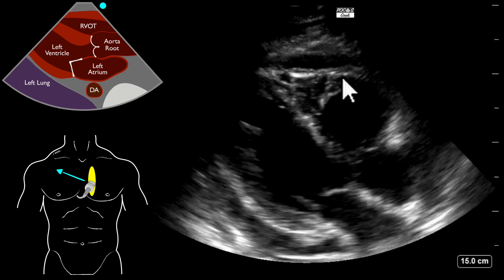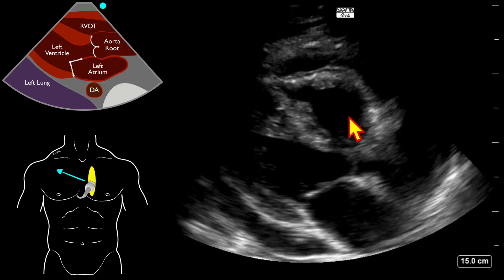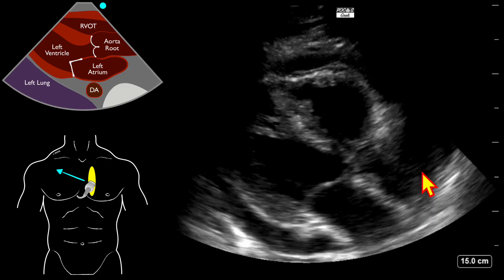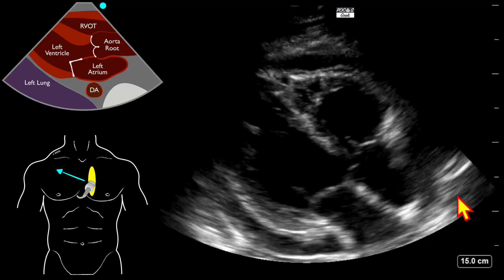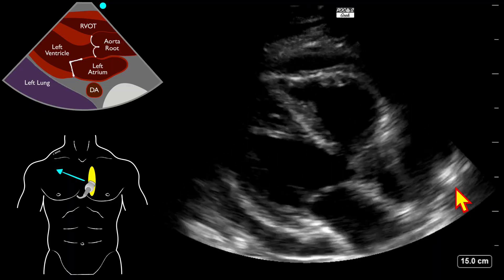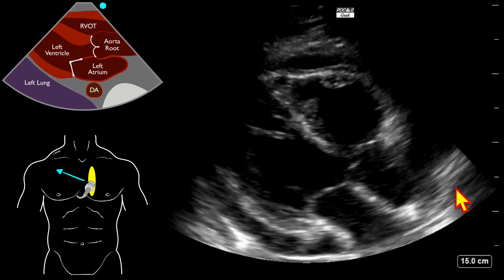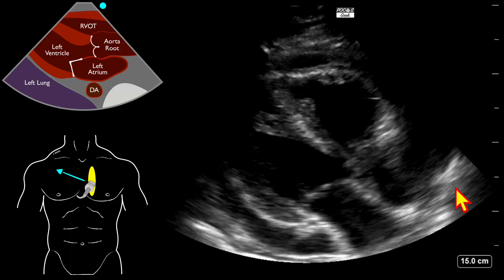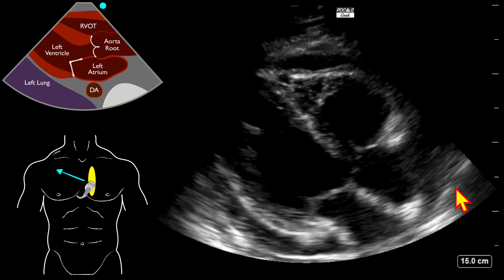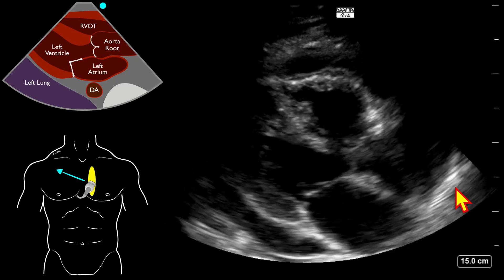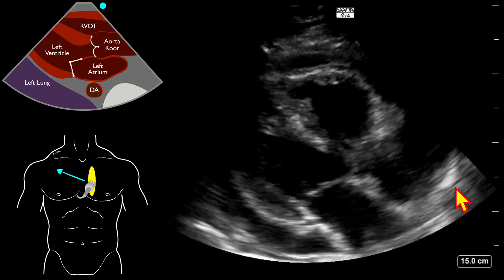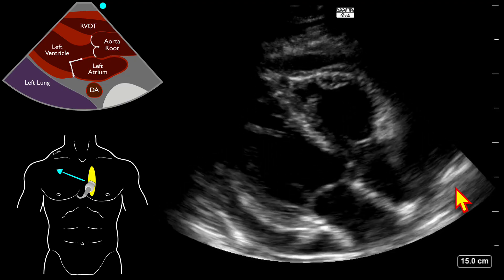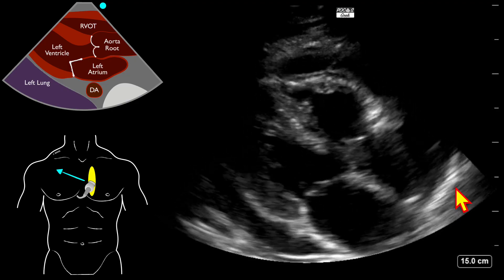The right ventricle is hard to determine EF on this view, given that we don't usually see it well in the parasternal long axis, which is what this is supposed to be. But we do see some of it up there, and it seems to have decent function.